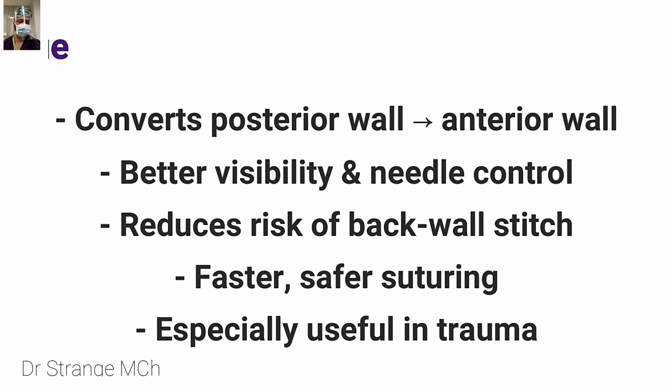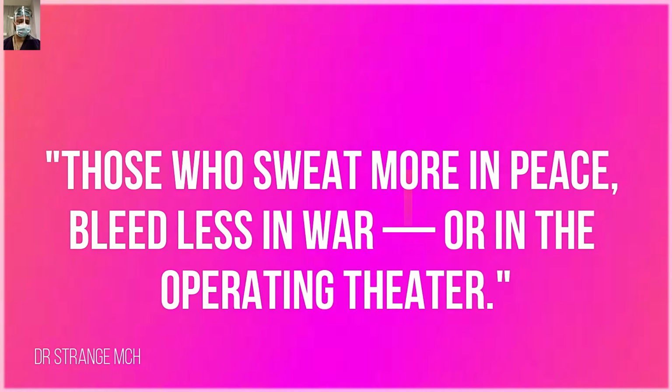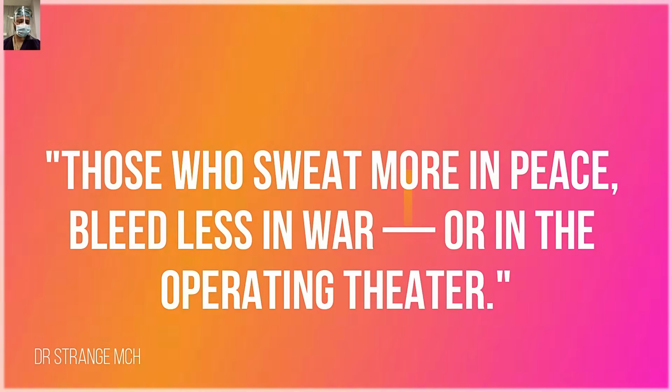The advantage of this technique is that you convert the posterior wall to anterior. There is better visibility, better needle control, reduced risk of back wall stitch, and faster, safe suturing, especially useful in a trauma setting. Keep practicing, friends, for the sake of your patient, and practice will make you perfect, and you will have an excellent recovery.